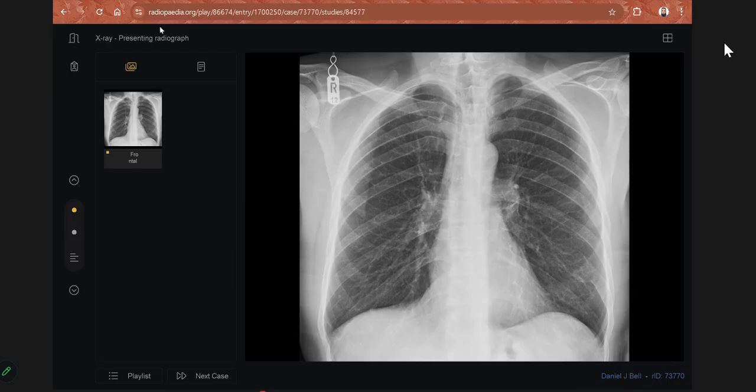Sure, sir. This is the chest X-ray frontal projection of a skeletally mature patient. I can see that there is bilateral bulky hila. Other than that, both costophrenic angles appear normal. I cannot see any pathology, any consolidation or collapse within the lung.